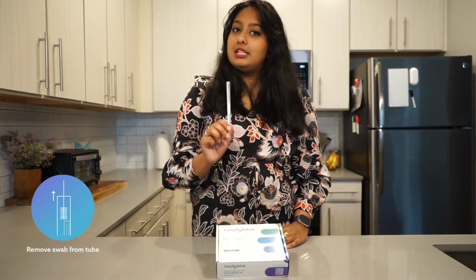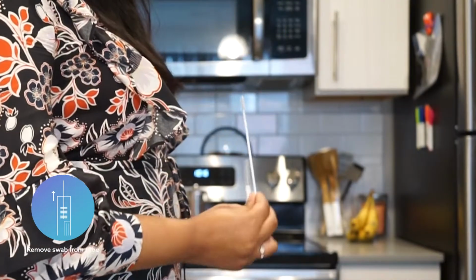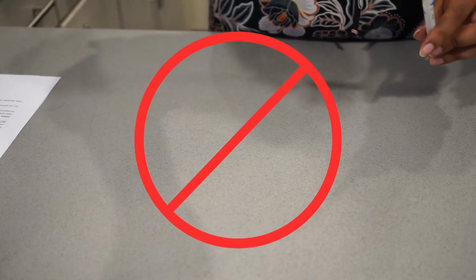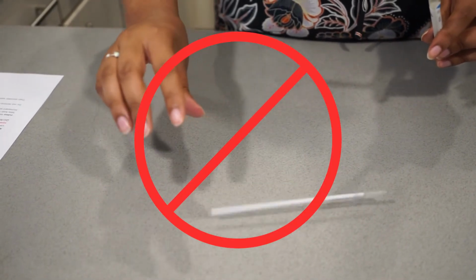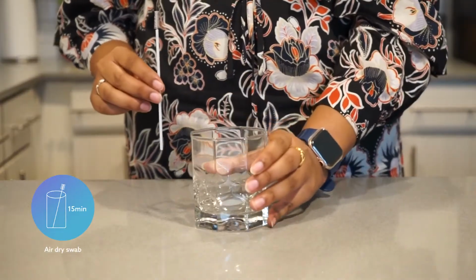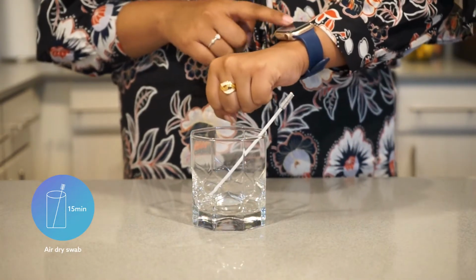Take 1 tube containing a cheek swab. Open the tube and remove the cheek swab with the tip of the swab facing up. Make sure the tip of the swab touches only the inside of your cheek and the collection tube. Using the bristle end of the swab, scrape the inside of one of your cheeks 20 times in a twirling motion. In a cup or container, place the swab bristle tip up and let it air dry for 15 minutes.